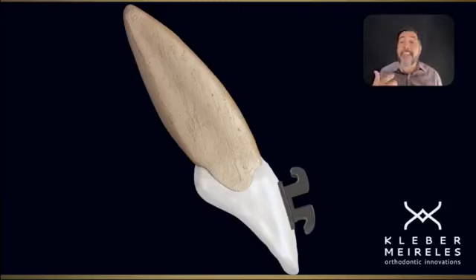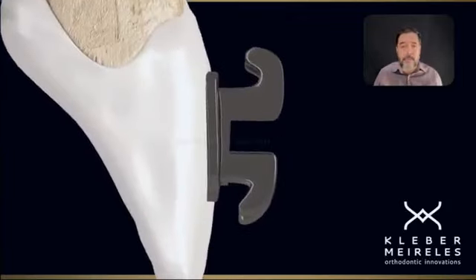So we're saving time in our daily practice, in our daily lives, because we can just insert the wire with neutral torque without the need of applying the torque, so we can keep or change the inclination towards the direction that I want. This is the general idea behind the torque, the prescriptions embedded in the brackets. What are the prescriptions that we see?